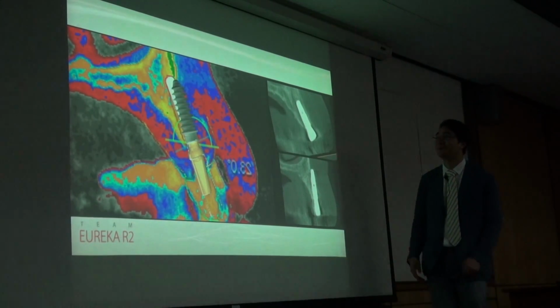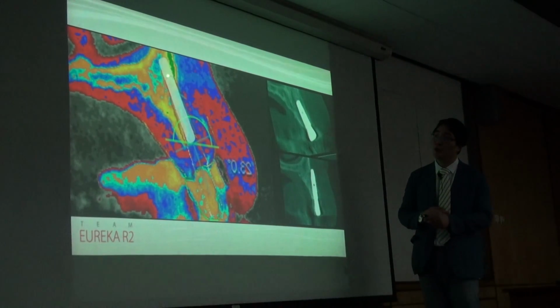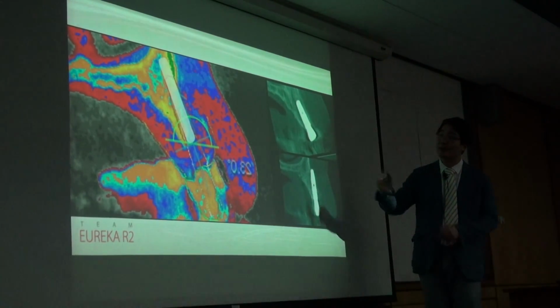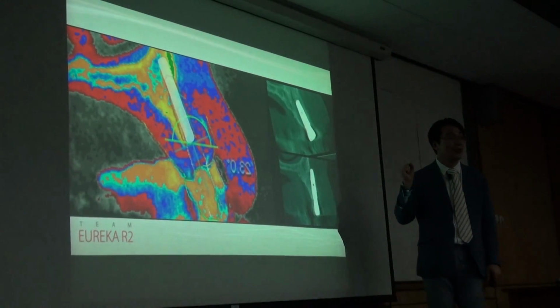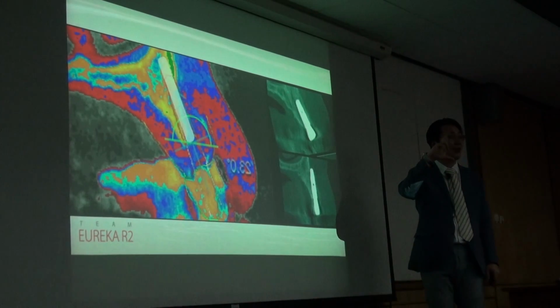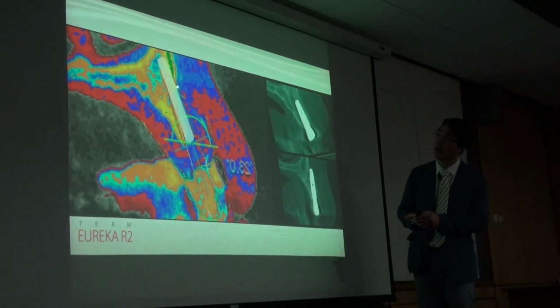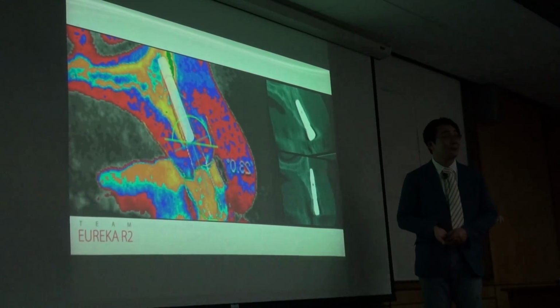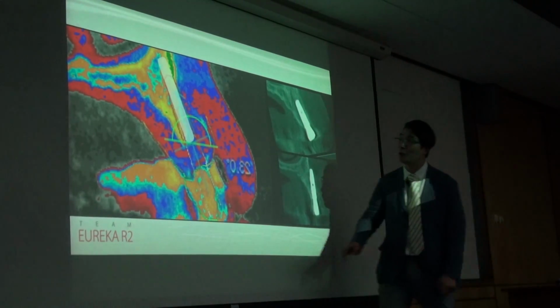So my suggestion is this. When we place the implant in a severe resorption site or extraction socket site, we have to choose, first, a long implant. So using a long implant, we have to obtain stability here. Understand me? Yes.